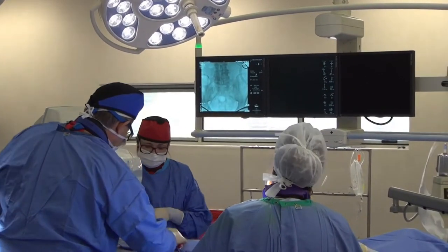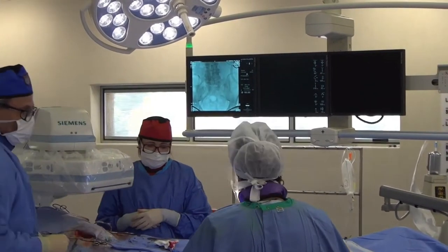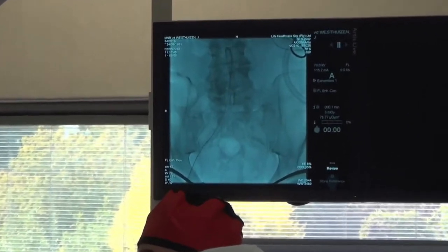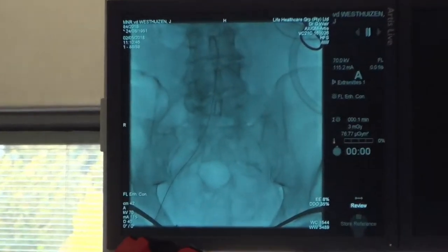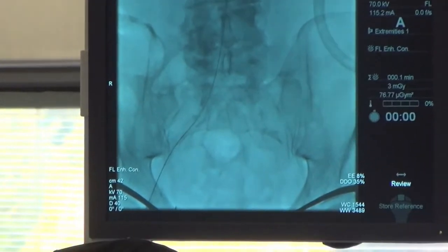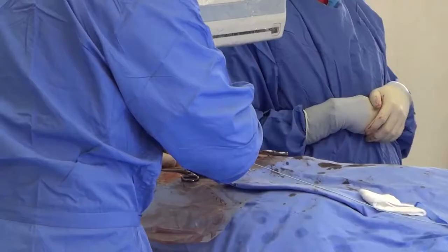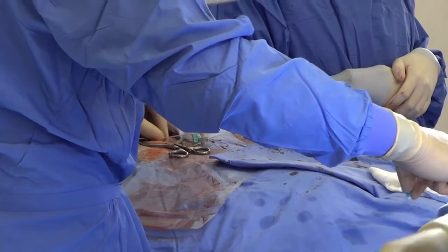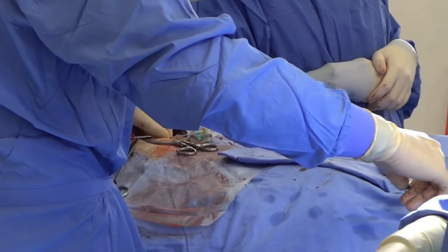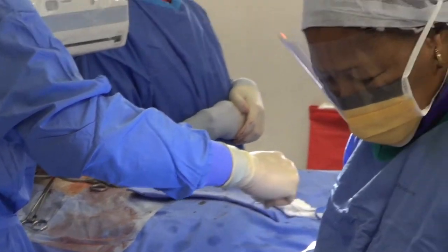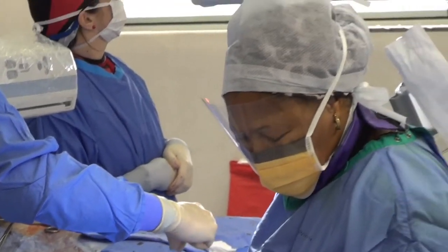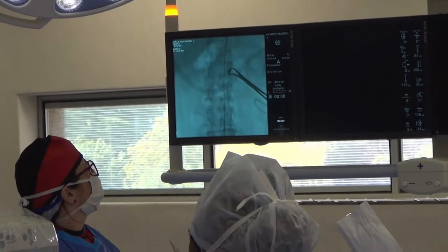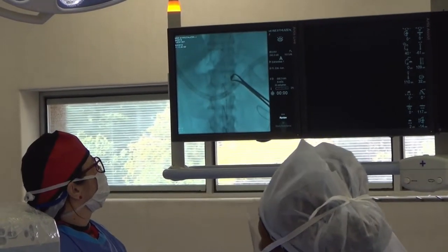A long guide wire is advanced through the sheath, through the aneurysm, and into the proximal aorta above the level of the renal arteries under x-ray guidance, also known as fluoroscopy. A marked catheter with a curled end, referred to as a pigtail catheter, is advanced over the guide wire into the proximal abdominal aorta just above the renal arteries under fluoroscopy.